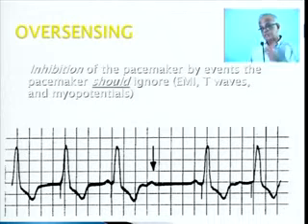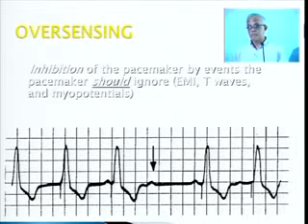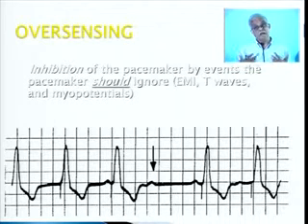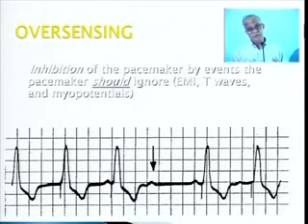Sometimes what happens is that these pacemaker patients, when they go near large transformers, near the airport, or go to the kitchen near a microwave oven, get disturbed because there is high electromagnetic activity. Those waves are sensed and the pacemaker keeps quiet. This is what is happening here. Muscle twitches, electromagnetic waves, and microwaves can sometimes lead to this. See here, it is keeping quiet because it is sensing some external electromagnetic waves.